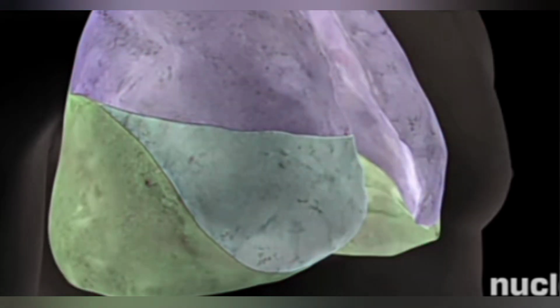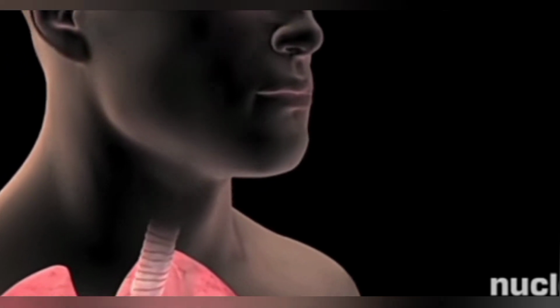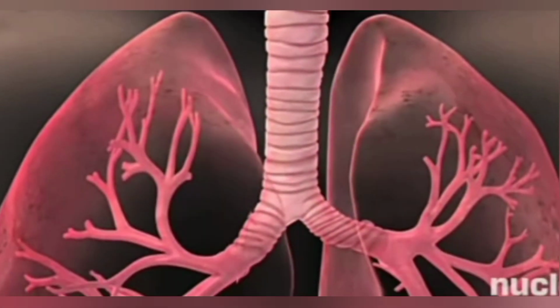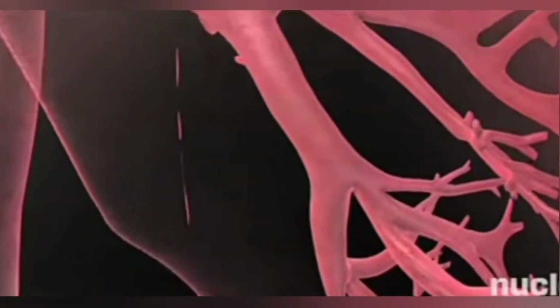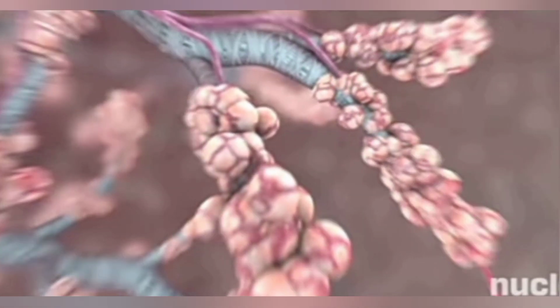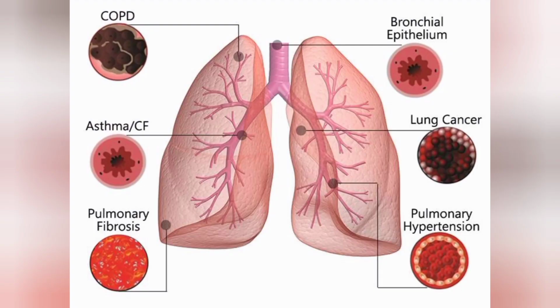Lungs take oxygen in and release carbon dioxide outside the body. In a normal human being, breathing happens like this, but sometimes someone may not have normal breathing capacity because of some diseases or defects in lung functionality. In such cases, the patient's body would not get enough oxygen, which would lead to death. In such cases, a ventilator is used for patients who cannot breathe themselves. So a ventilator is nothing but a supporting system in cases of breathing system failure.